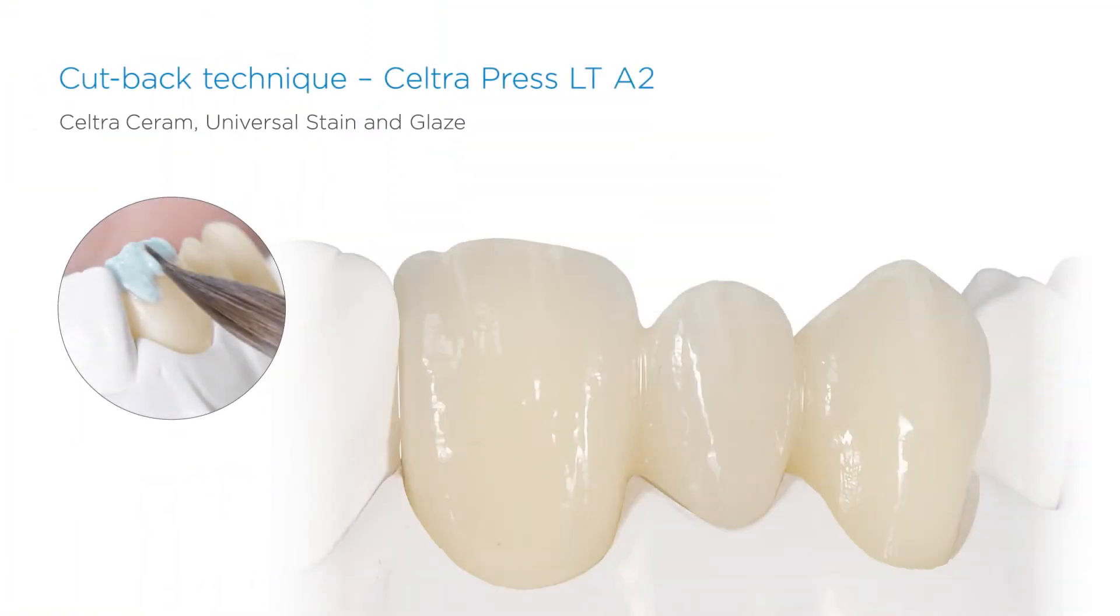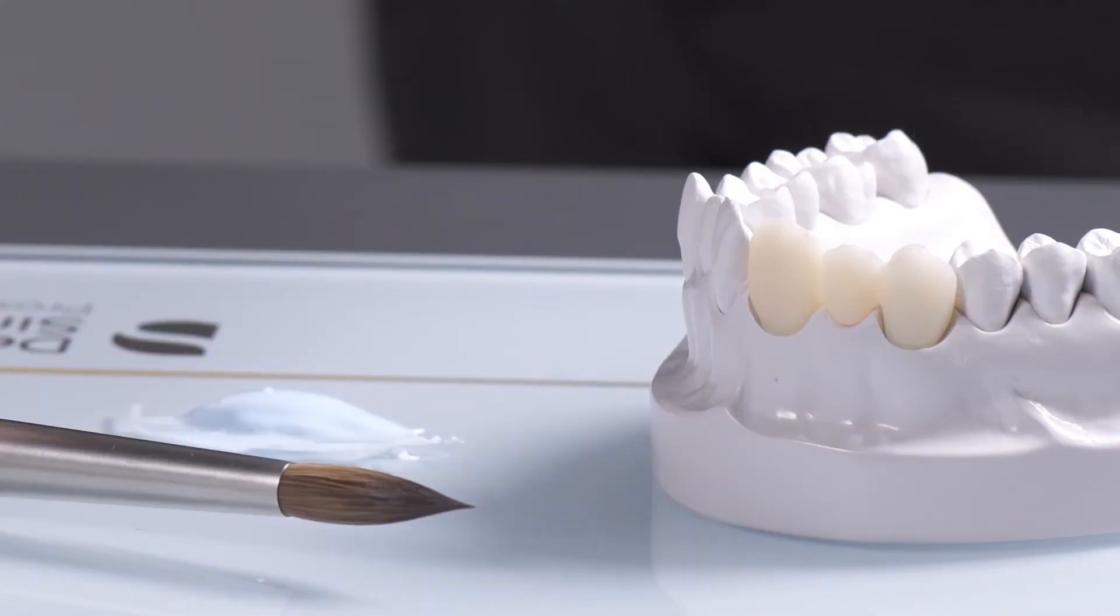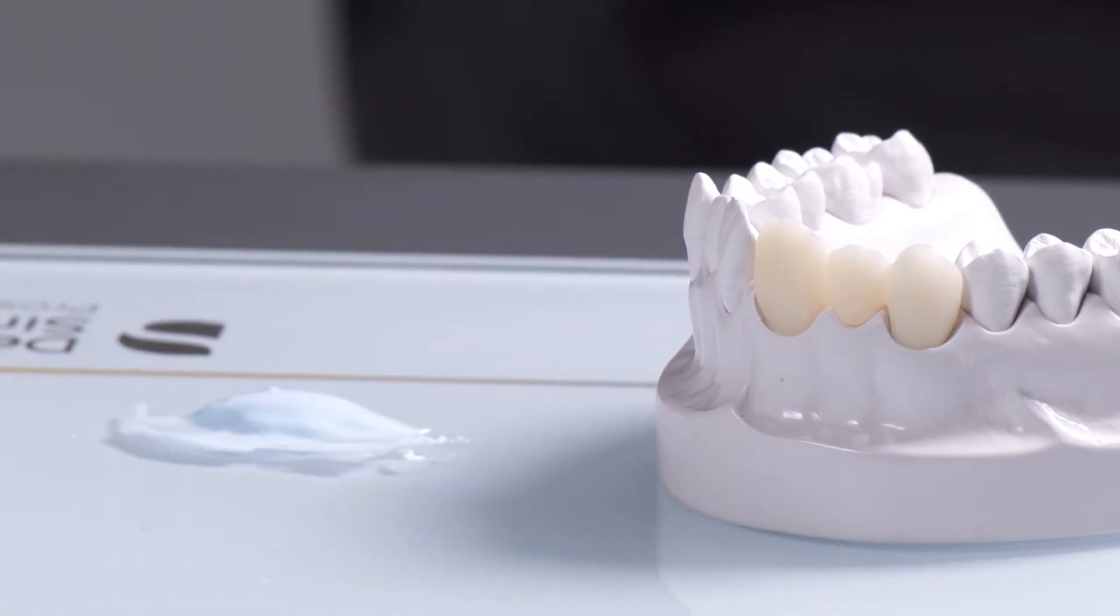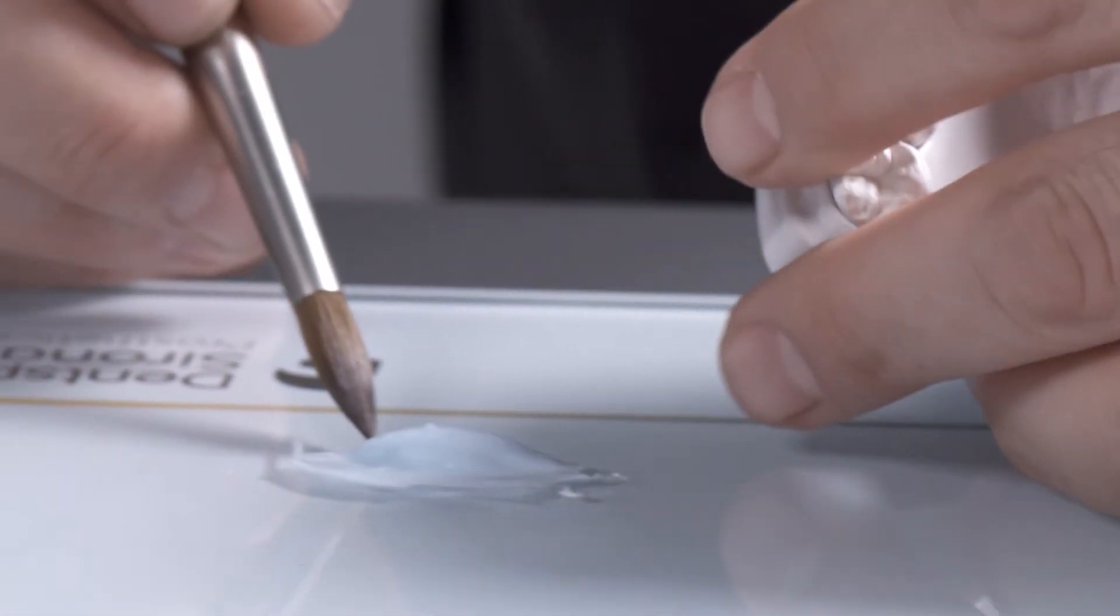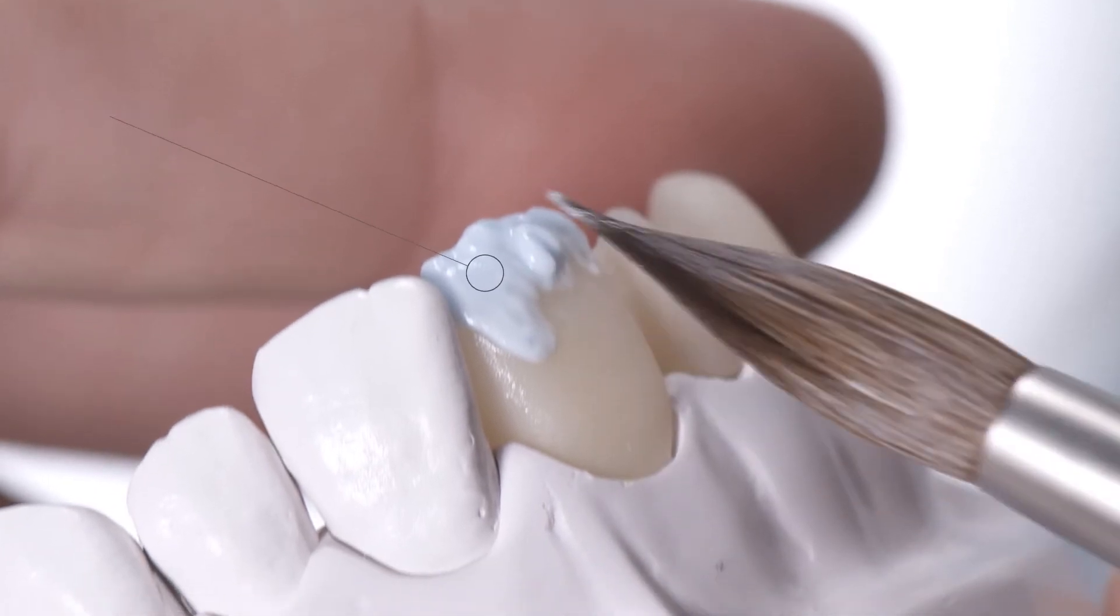Seltra Press already provides a high level of aesthetics in monolithic mode. Using the cutback technique with just a single incisal material, this aesthetic result can be further enhanced. For this, we use Seltra Ceram Enamel E1. The mamlon structures were created when designing the framework.